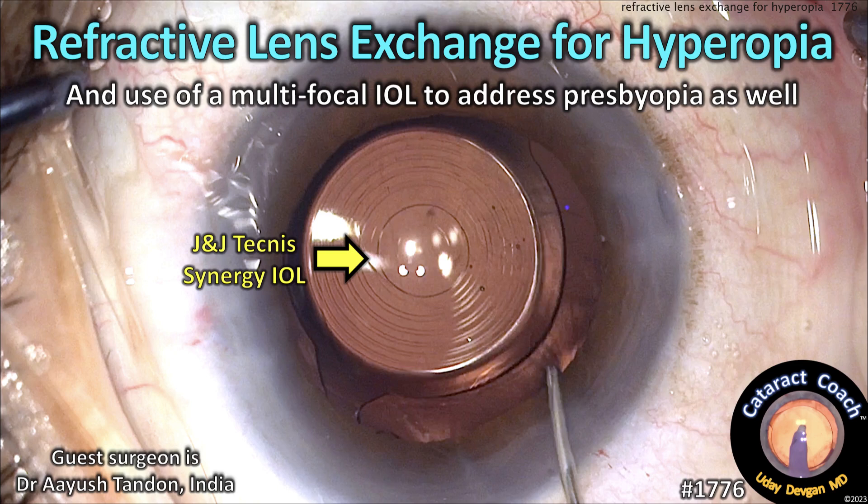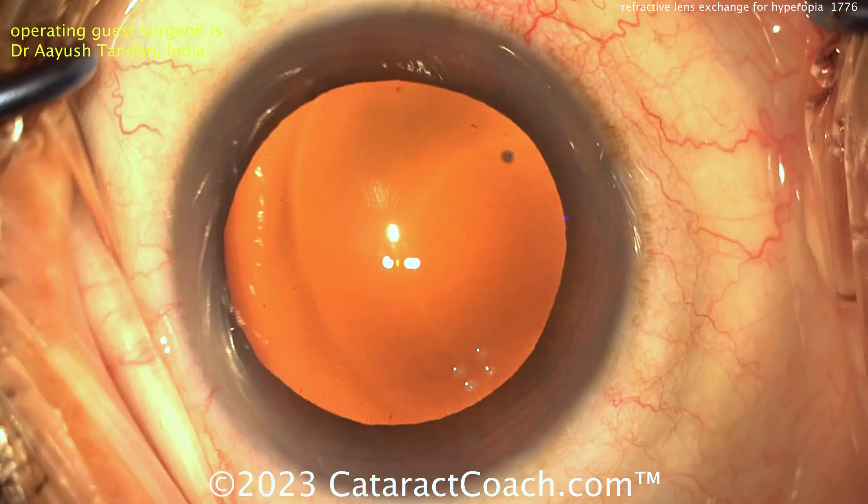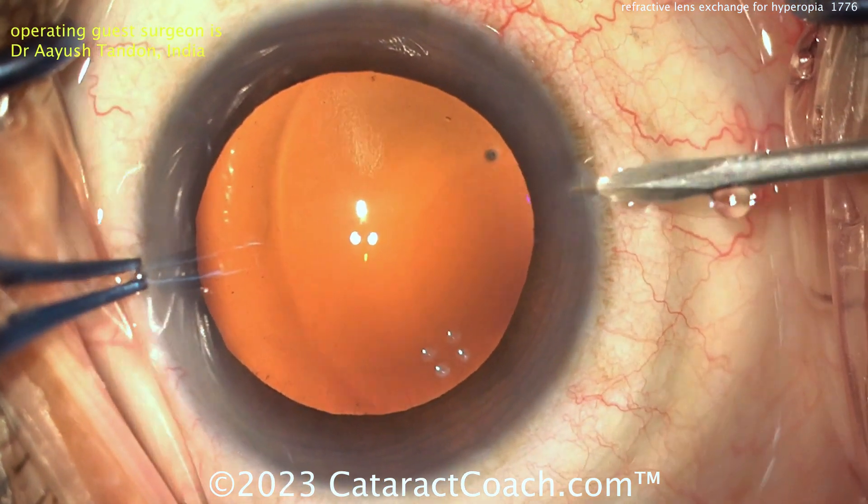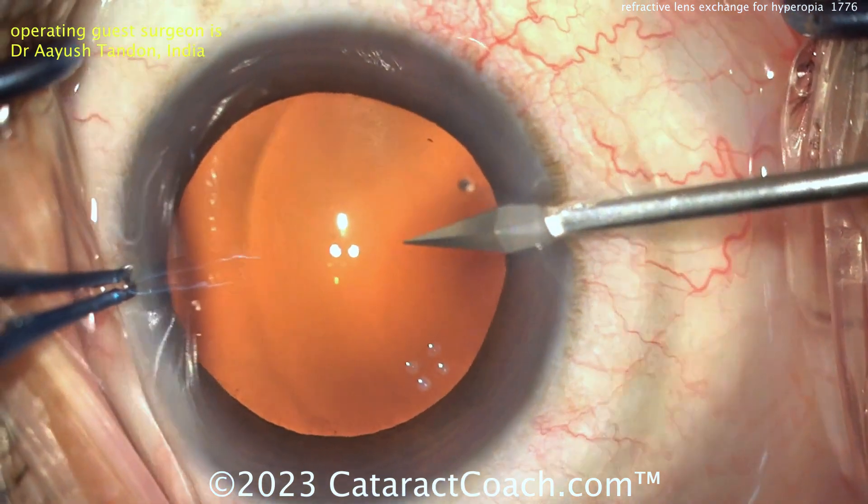cataractcoach.com — refractive lens exchange for hyperopia and use of a multifocal lens to address presbyopia. Here's the patient: a plus 3.5 hyperope and also a presbyope, well past the age of 50.